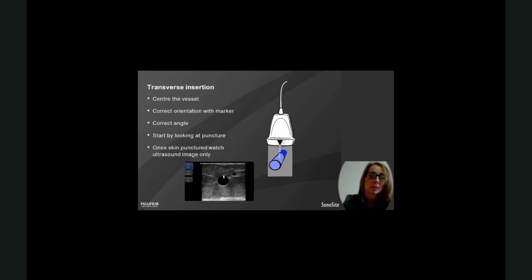You'll usually know you're about to puncture because the vessel starts to tent in, starts to bow in, and then it pops through. Then as you're threading along, you can make sure you level out and don't continue through the back or the side walls, and you can watch yourself moving down the absolute centre of the vessel until your needle's in as far as you want it to go.